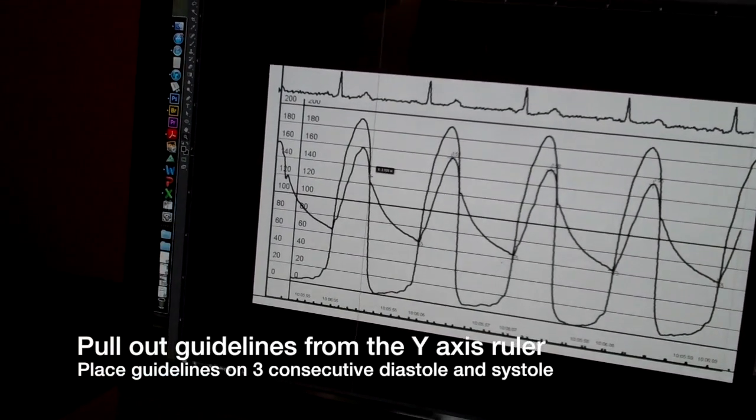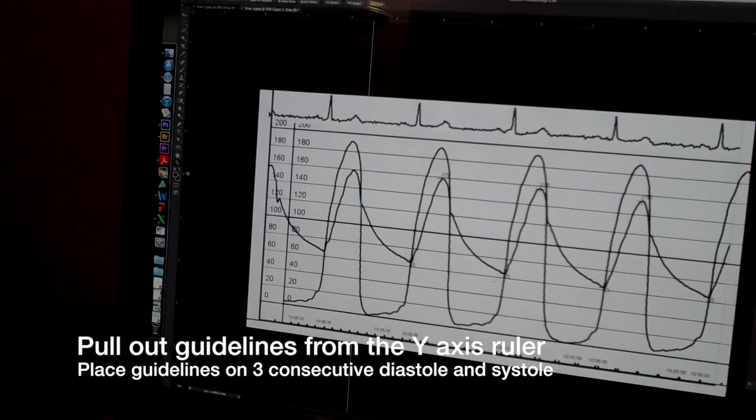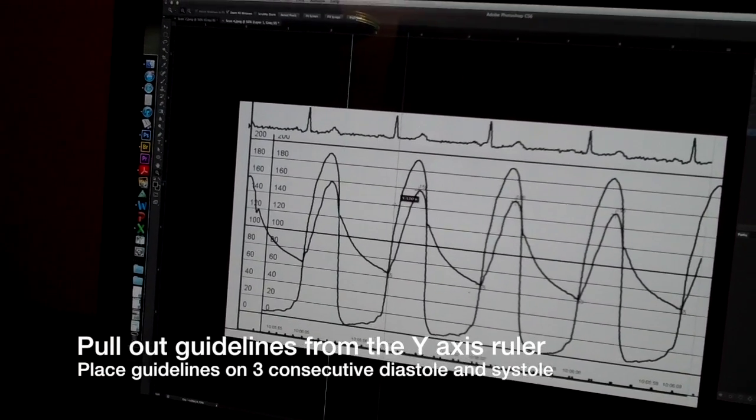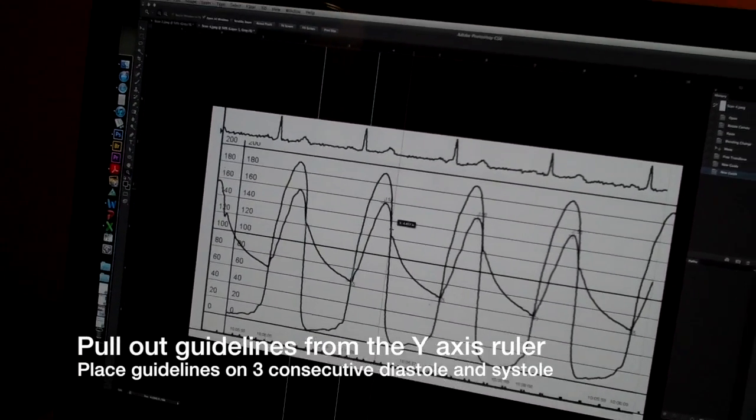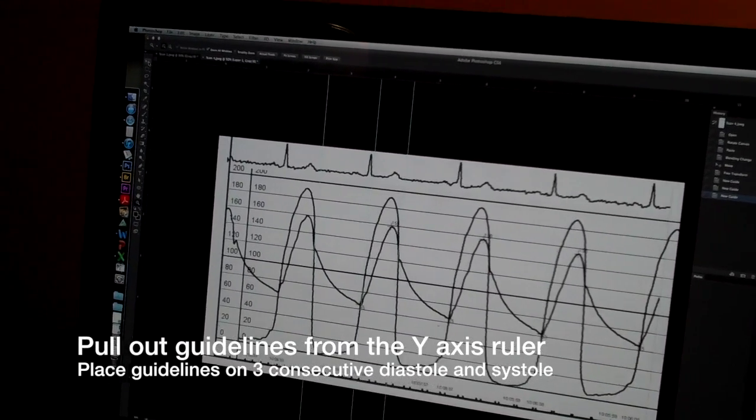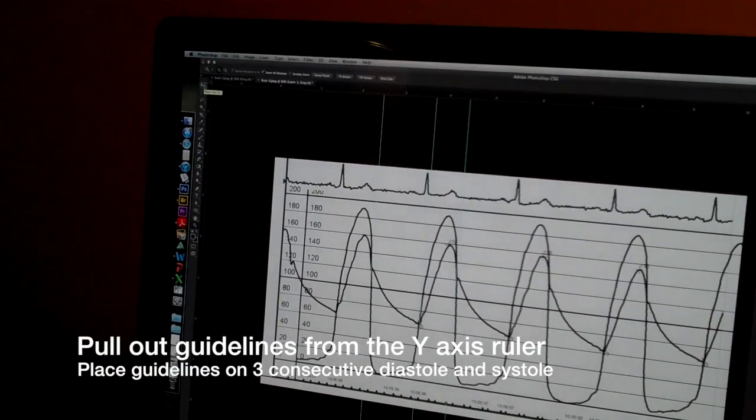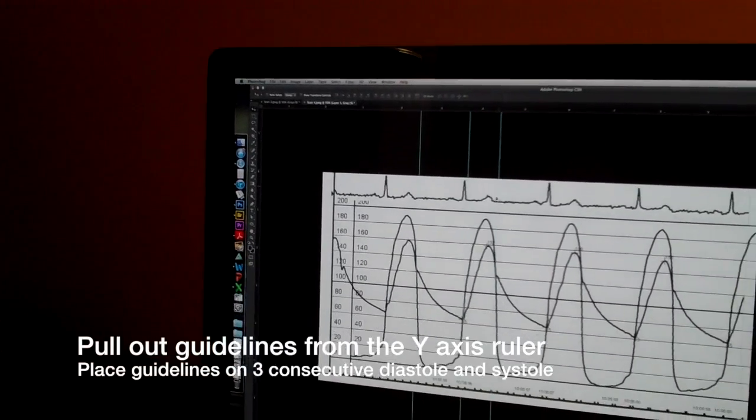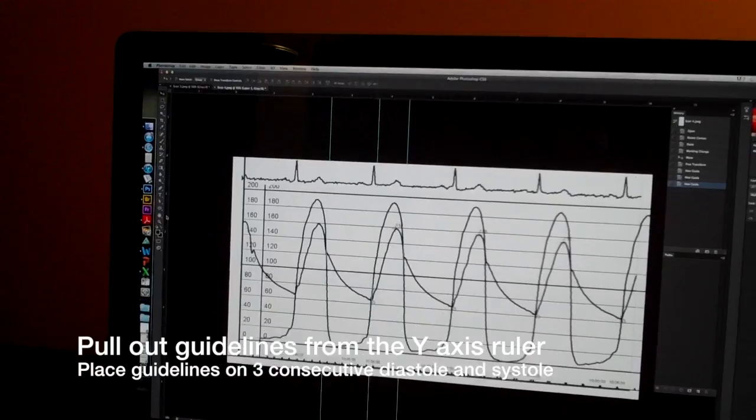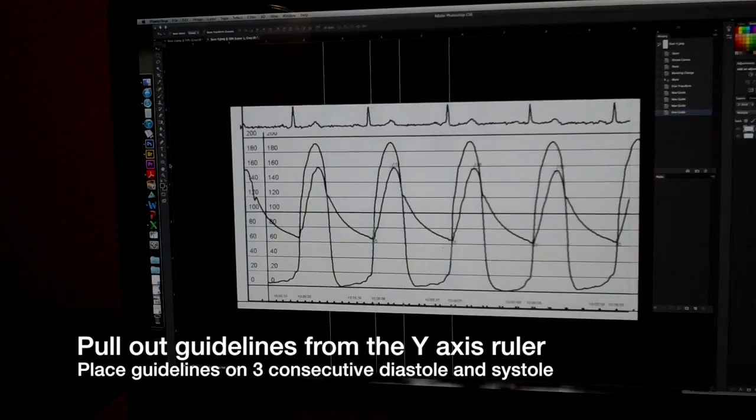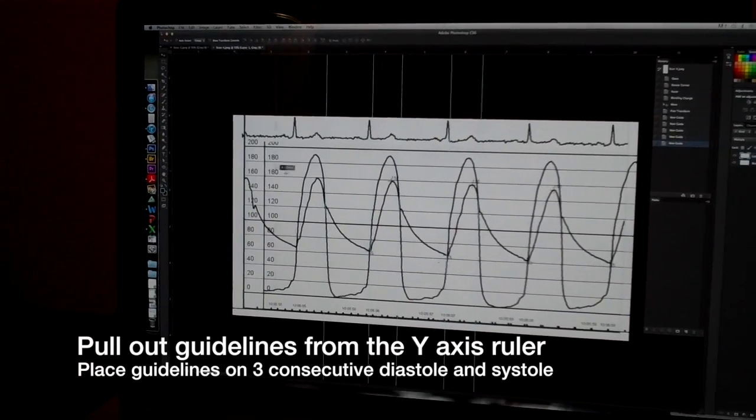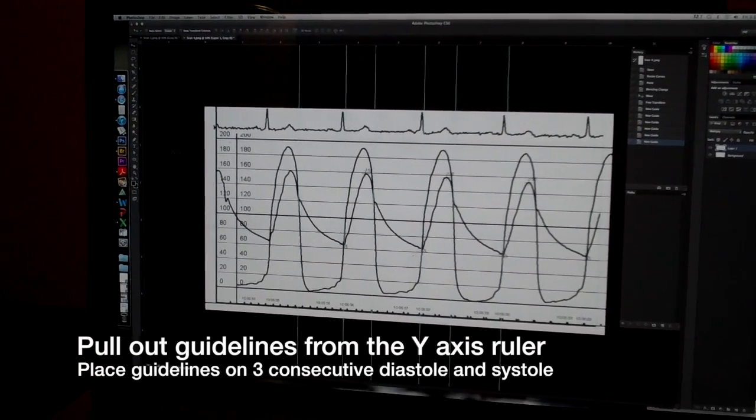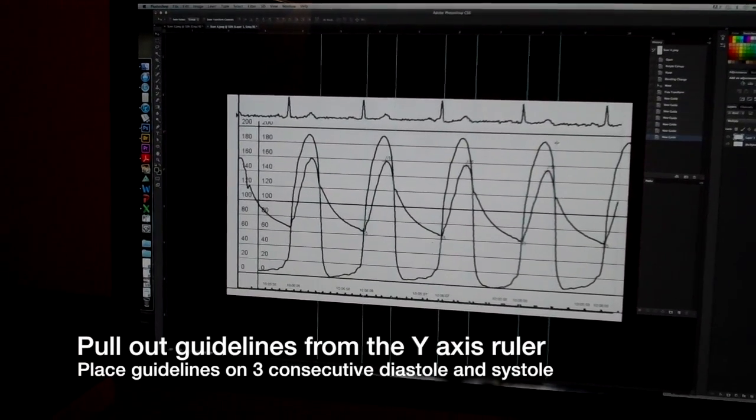And so there's the first diastole. I'll pick out another ruler. So I go over here until the cursor turns to an arrow, hold down the mouse and pull out the second one until it reaches where I want and then let go. If I want to move one of these around, I need to go up here and change to the move tool at the top of the toolbar, or use the V key, which is the keyboard equivalent to it. So I'm going to get another ruler and put it here. That's one, two beats. And that's three diastoles and three systoles.